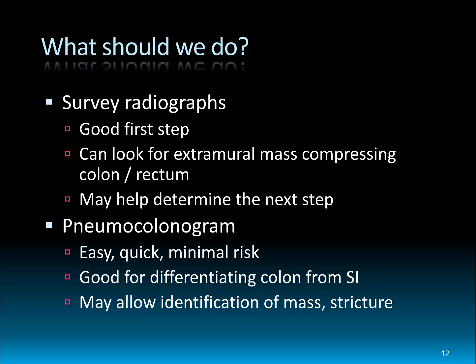Nonetheless, survey radiographs are always a good place to start because you might get the answer. You can certainly look for masses if they're big enough, whether they're outside or extending into the colon. You may be able to see them with radiographs. And depending on what you see, you may have a good idea of what to do next.